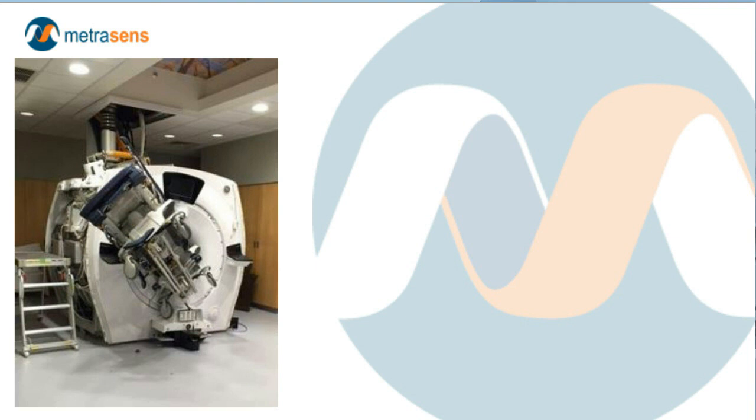So while the ultimate decision to roll this patient bed into the MRI scanner room was made by a staff person, that person may have made that decision based on the unavailability of an MR conditional device or storage that wasn't in the functional path of taking care of that patient, or the absence of a patient lift system for this particular patient. There are a number of elements related to the physical environment that shape the decision-making of the clinicians at the point of care. And we, as designers, need to understand our role in that part of the process.